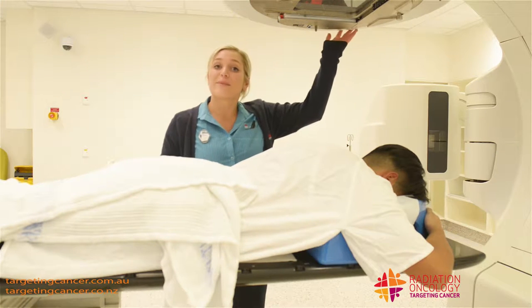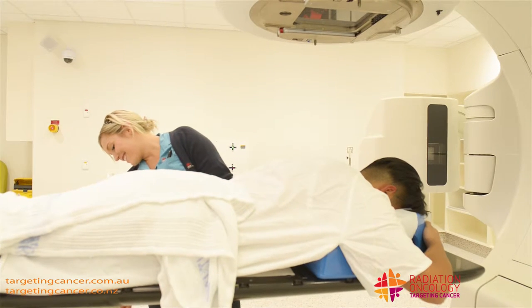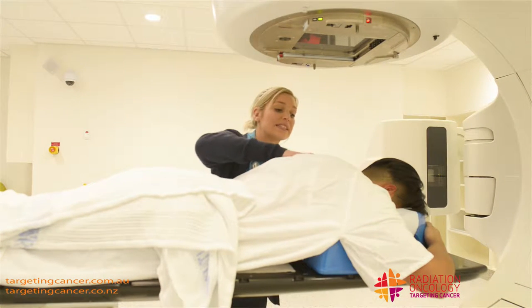This is all coming from the top of the treatment machine here. I just raise the bed up to the planned height, which I can check as well. We have a little light here that gives a reading on the skin.